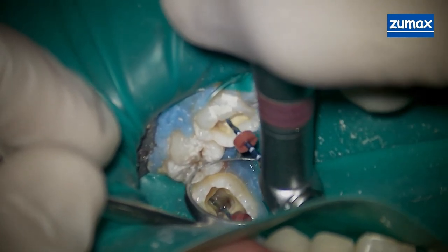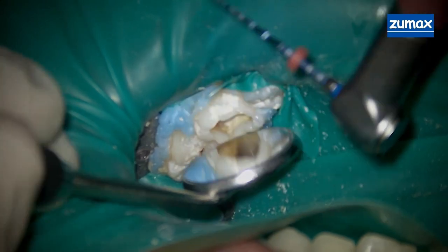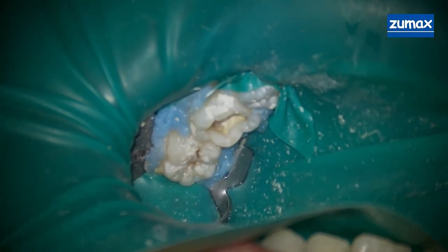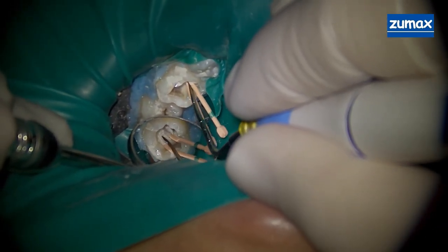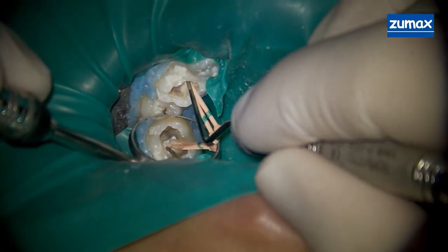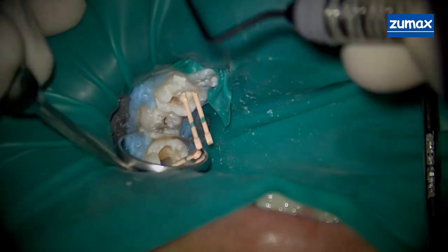After you've reached your master apical file size in each canal, you take a radiograph with the files in the canals to ensure proper length — I don't show that in this video. We then treated the canals with EDTA, let that soak for two minutes, irrigated to rinse the EDTA, and dried the canals with paper points.